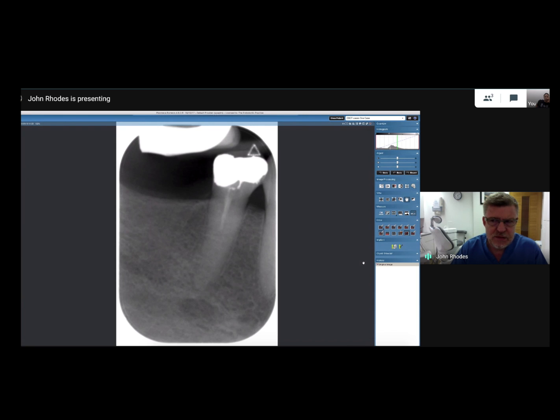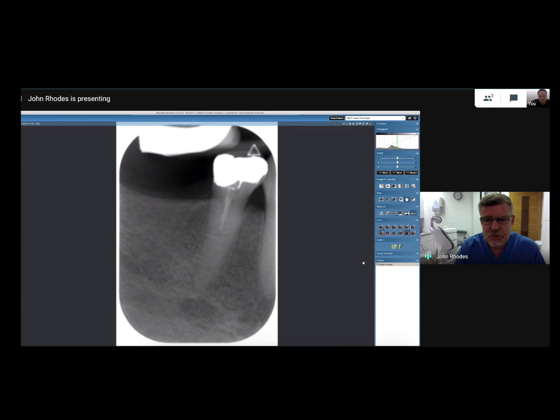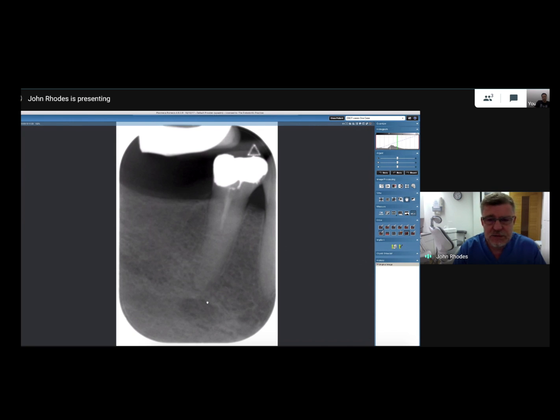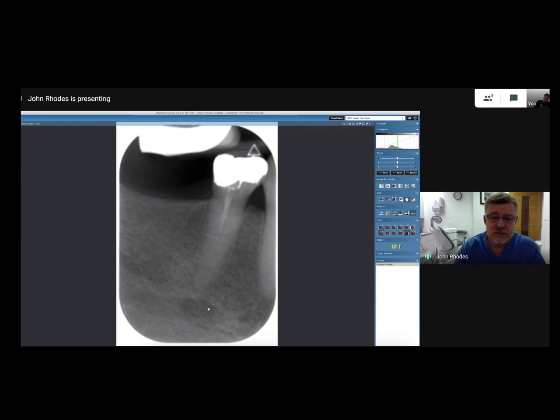Case number three: this tooth was referred for root canal retreatment of the mandibular right first or second premolar. The GDP had been unable to instrument the canal to the apex and had seen an apical area they thought was periapical periodontitis. This gives us an indication of why you want two or three good indicators before root filling a tooth — a vitality test may not have been done in this case. Because as you can see, this isn't periapical periodontitis; it's something else in the mandibular region.